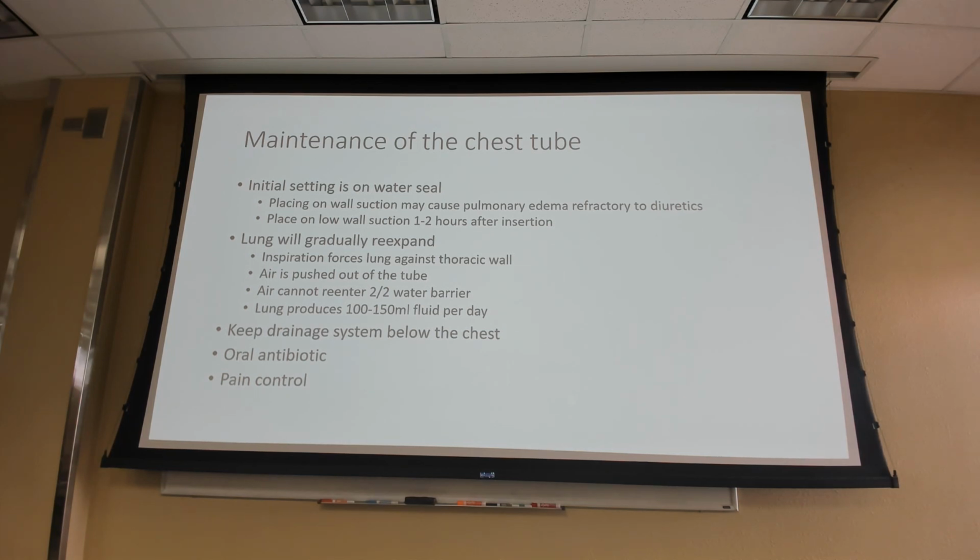Typically they don't balance really well, but they come with little legs on them that you can turn outside. They also come with little handles that attach to the bed, so it's important that we're not just leaving it on the ground, especially if they're a polytrauma patient with other injuries or walking around. We don't want to knock that Pleurovac over. Then we need to consider pain control, antibiotics, and prophylactic treatment for these patients.